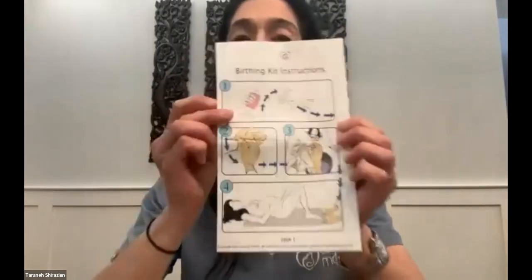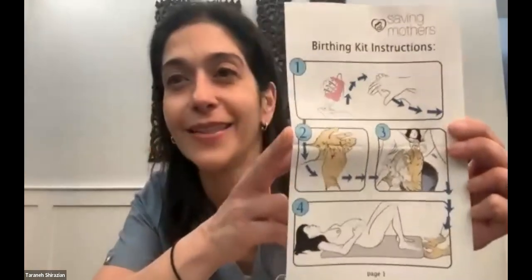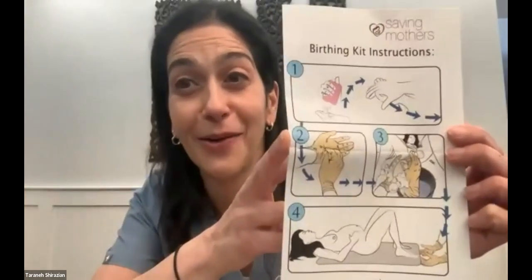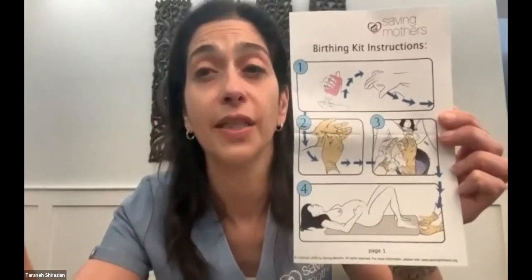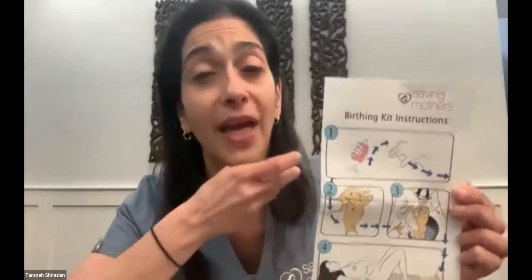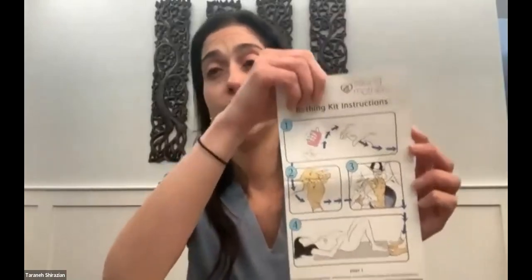Now, the first thing, well, this one has others. This has this instructional sheet. And I don't know if people can see it, but it's like an IKEA diagram, I call it. So it's a flow sheet. It doesn't actually require that anyone be literate. So that's really important. We make use of pictorial diagrams in order to educate, because in many areas of the world, you know, these traditional birth attendants and even the women themselves are not literate.